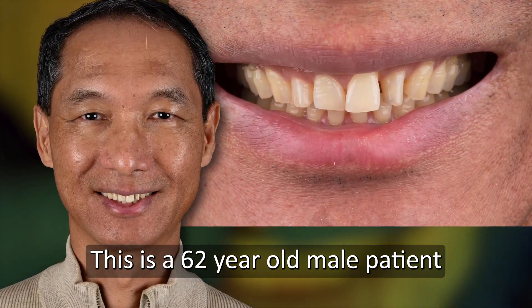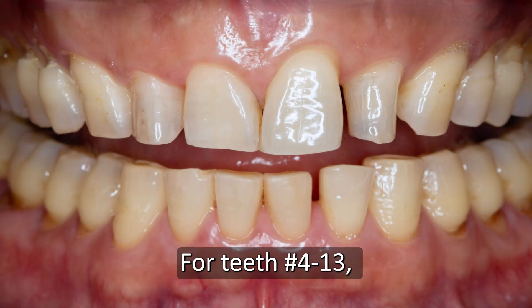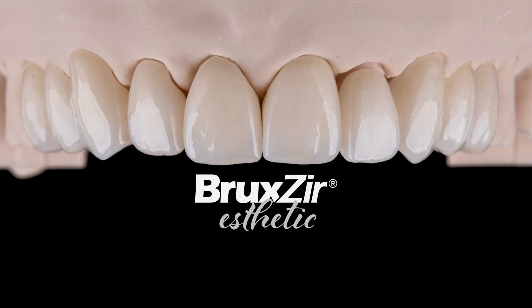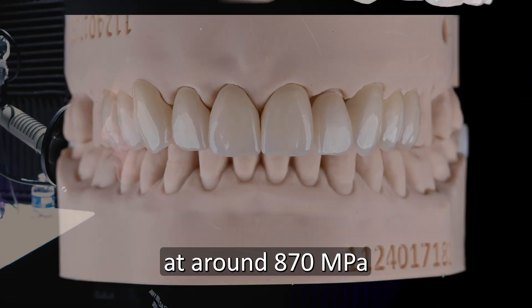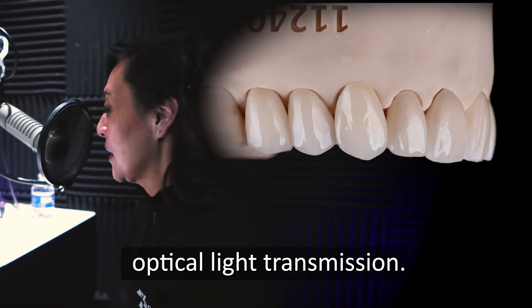This is a 62-year-old male patient who wanted a smile makeover. For teeth number 4 through 13, I chose Bruxer Aesthetic Zirconia Veneers for its beauty and strength. This product has high flexural strength at around 870 megapascals, with more translucency and enhanced optical light transmission.